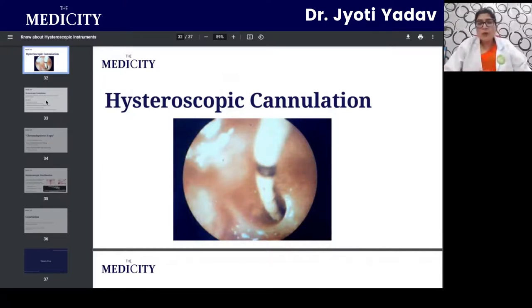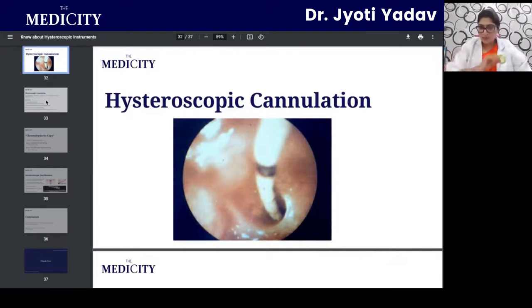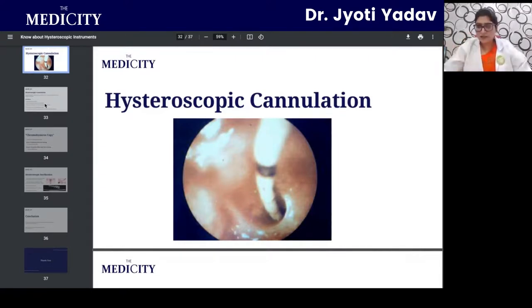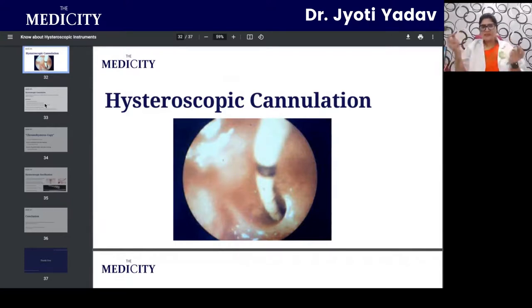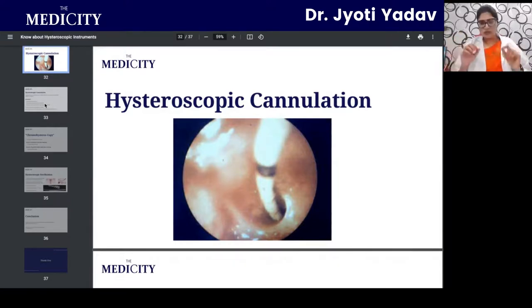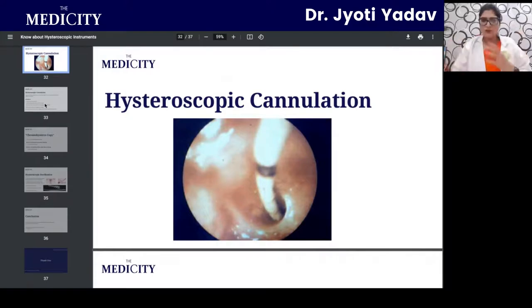Osteal cannulation is demonstrated: a cannula is placed at the uterine ostium and when media is flushed through, any adhesions present at the ostial part get opened with the flow of fluid.